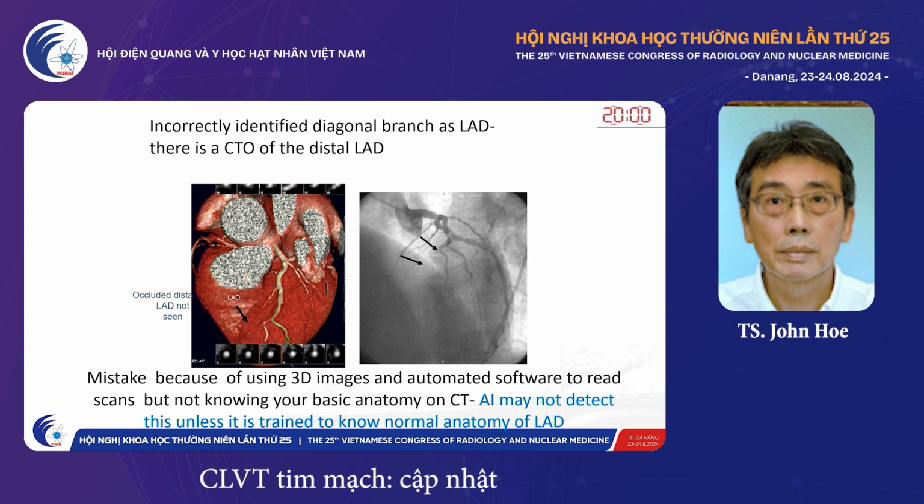So you should not miss this, because this mistake is because of using 3D images and automated software to read the scans and not knowing your basic anatomy on CT. I'm not sure if AI will detect this until it's trained to know the normal anatomy of the LAD.